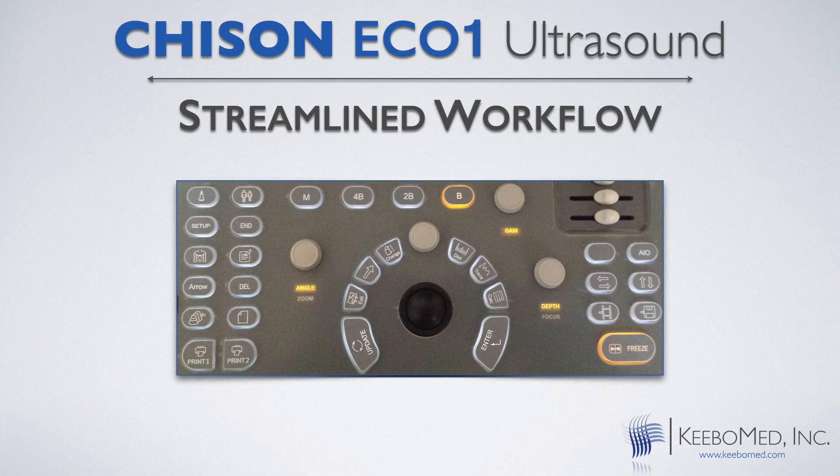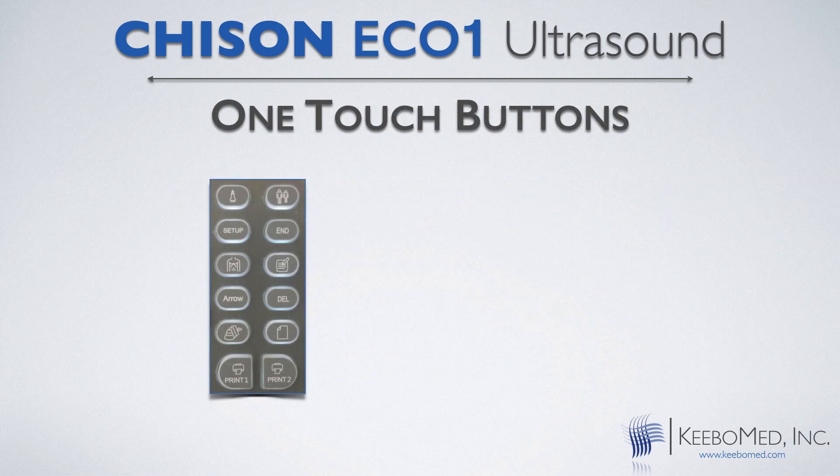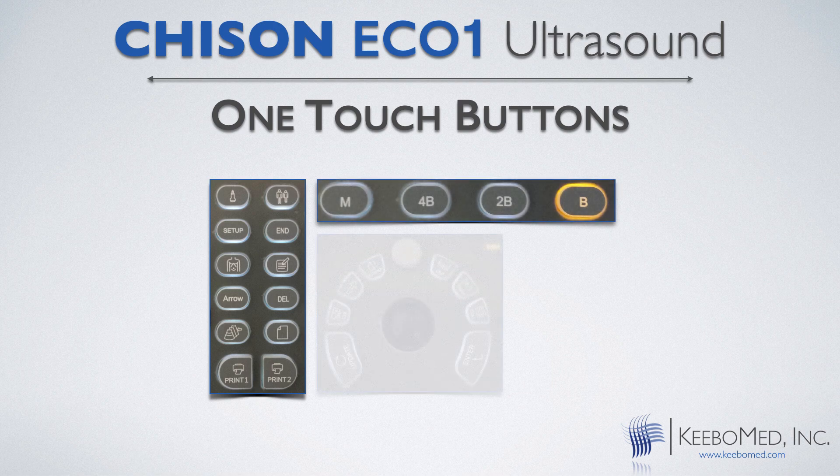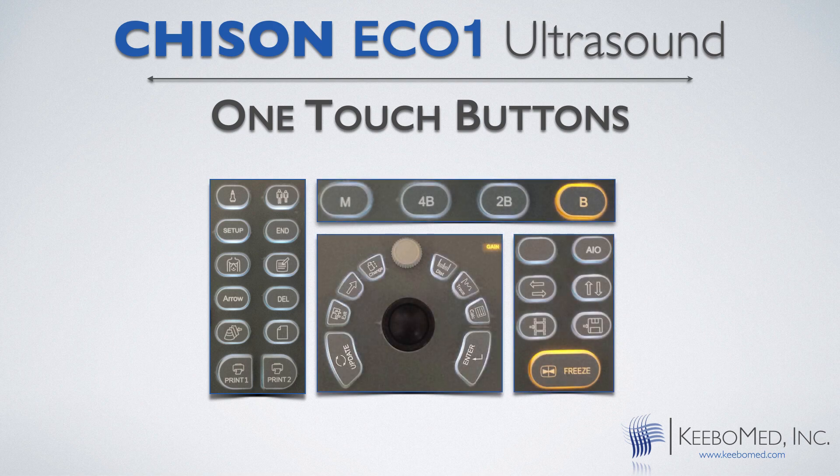It features a streamlined workflow and it has many one-touch keys. Some of those keys include image saving, cine saving, review, report, PC print, video print, measurement, and also advanced image optimization.